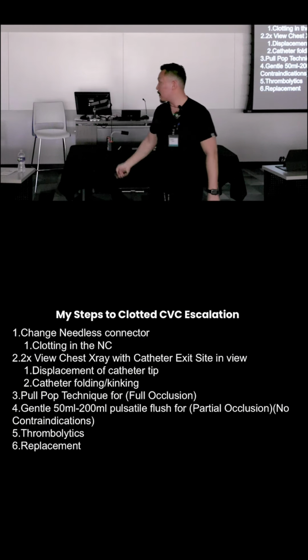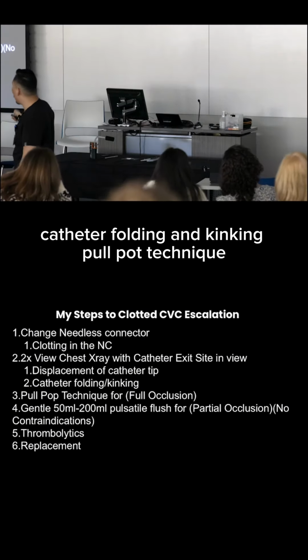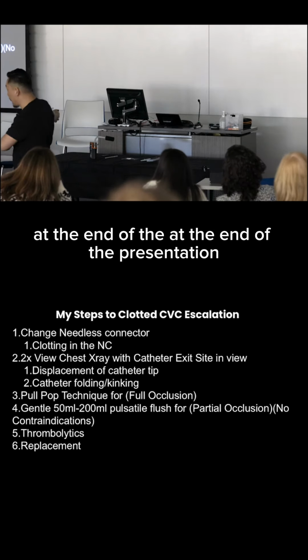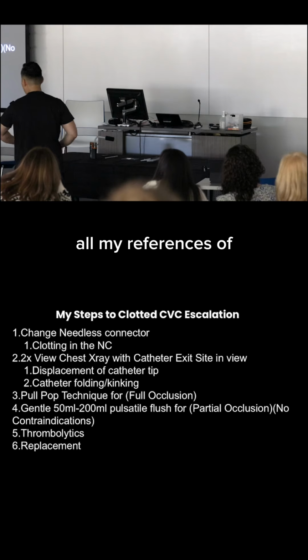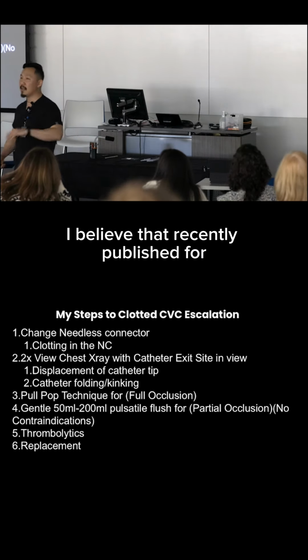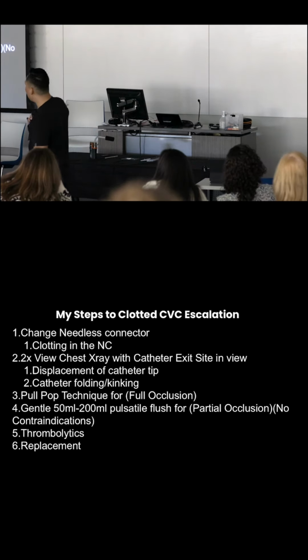That's why. Okay? Now, displacement of the catheter tip, catheter folding and kinking, pull-pop technique. This is controversial, but I have studies to back it up. At the end of the presentation, all my references for everything I'm talking about are in there. They did a study in 2020, I believe, recently published to show the efficacy of this.